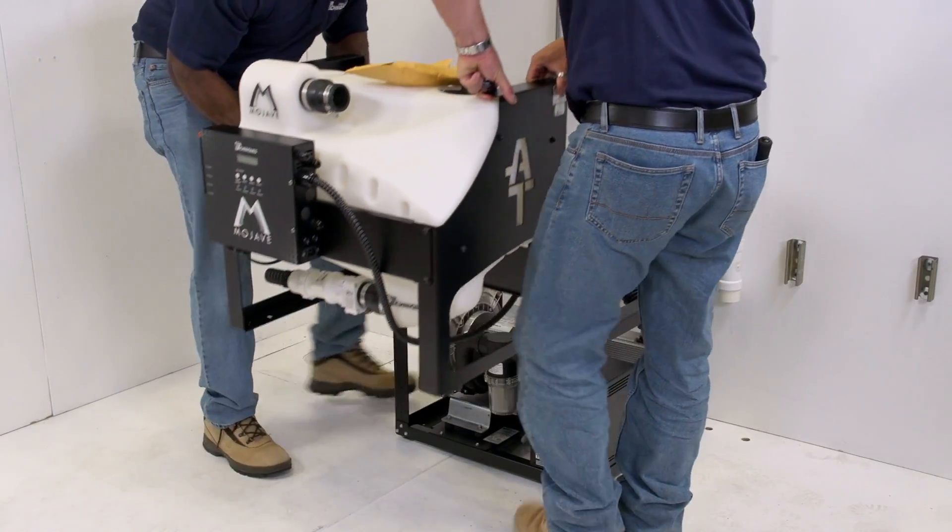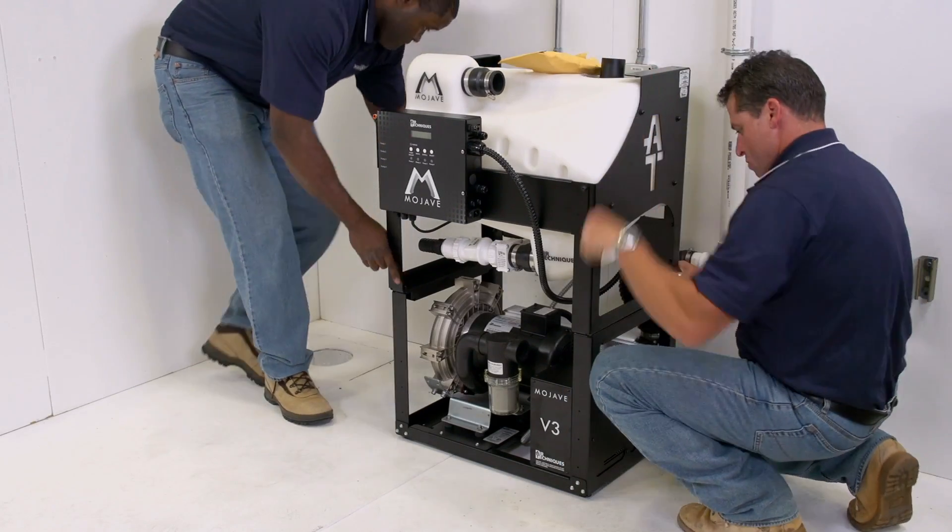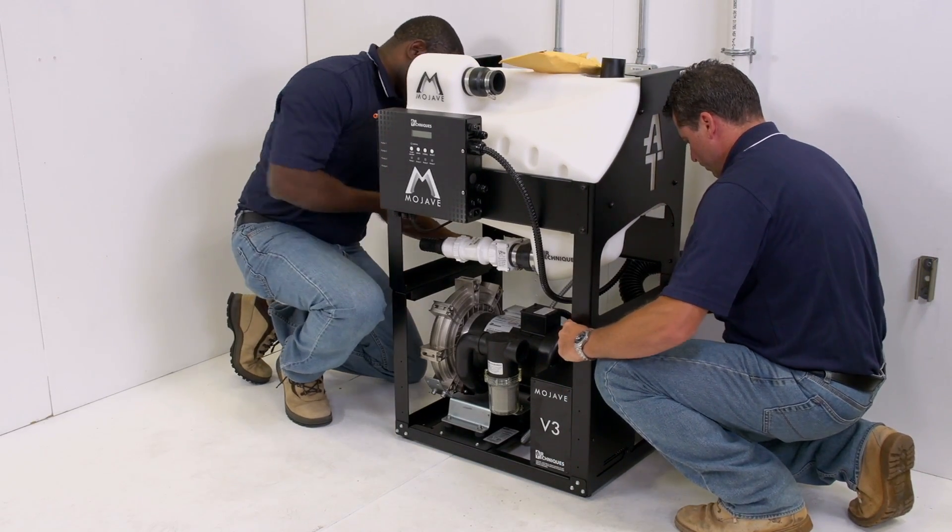Next, place the tank in the chosen location and stabilize using the tank feet to secure tank-to-pump chassis, making sure it's level.